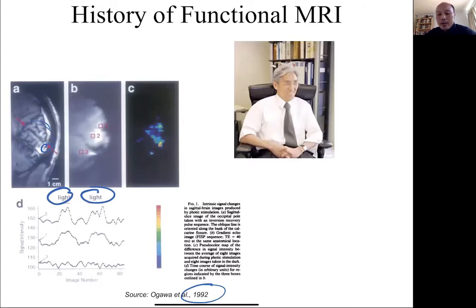That's a good question. We will in a later lecture. This particular type of background suppression is probably not the most popular way to look at vessels. I'm not sure that they're actually used live, but definitely for pre-surgical planning, we will acquire what are called angiograms, or MR angiography, which we'll talk about probably on Monday, where you can actually see what the vessels look like and see where the occlusions might be. So those would probably be used both pre and post surgery.